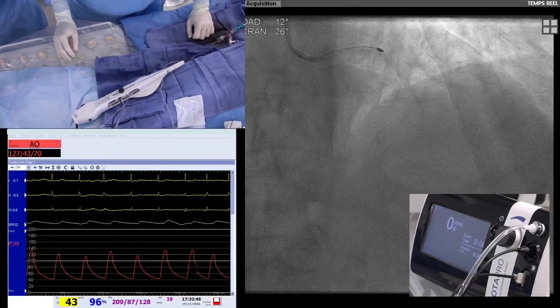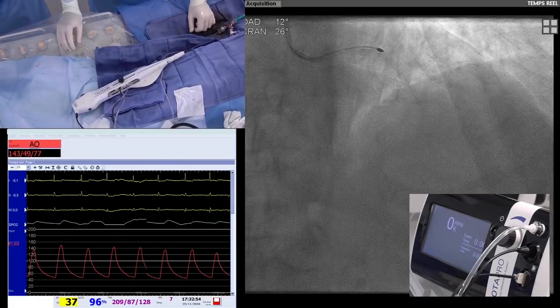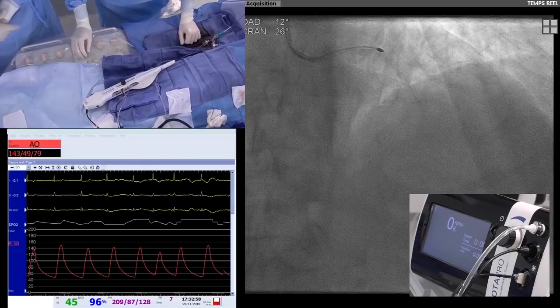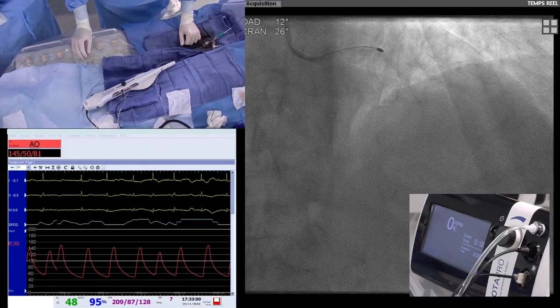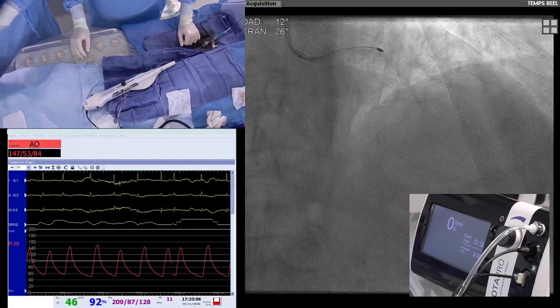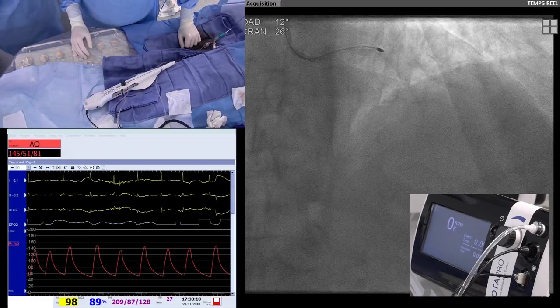An empty arrow tells us that the speed has gone down around 5,000 RPM, more or less. When the arrow is full, it means 10,000 RPM. This is a warning sign that we might have too much deceleration, and this, of course, might be portending complications. You also have to listen to the sound of the burr.